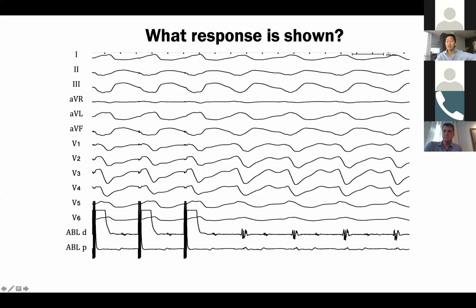Well, again, look during pacing. Which one is no longer seen? That is the one that is directly captured. Well, I don't see this big one during pacing. It's no longer there. But I still see the small little guy right there. And it's there, and it's there.